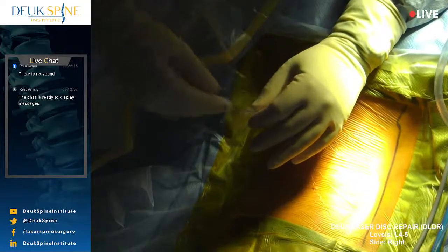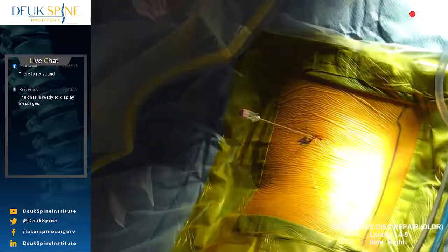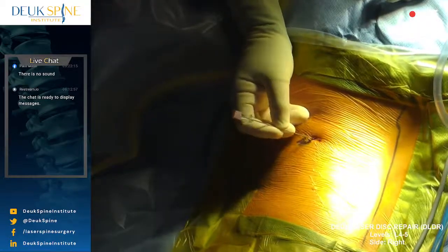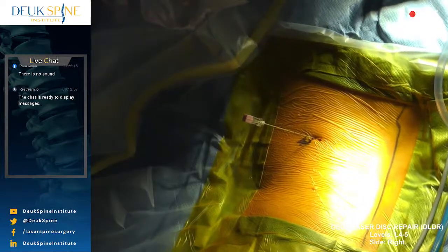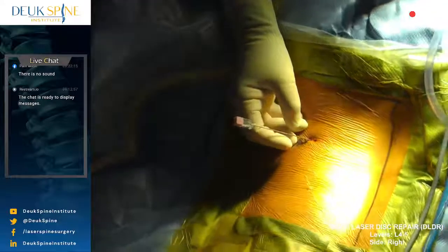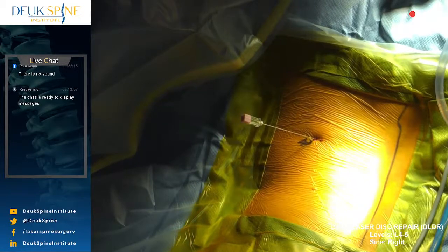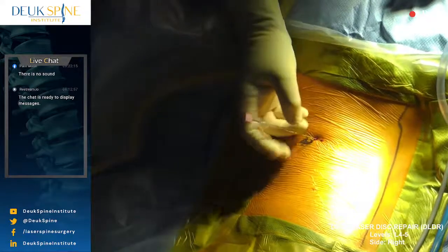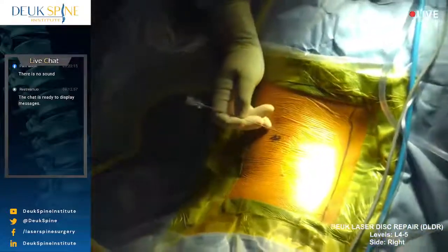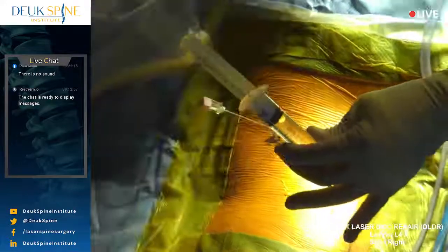So, everybody responds differently to the little bit of pain that's associated with the procedure. Some people are basically ambivalent, whereas others are very sensitive. He's fine. Let me see if I can give you a little more numbing medicine. Give me a second. Let me know when it's uncomfortable. Yeah, I see that.